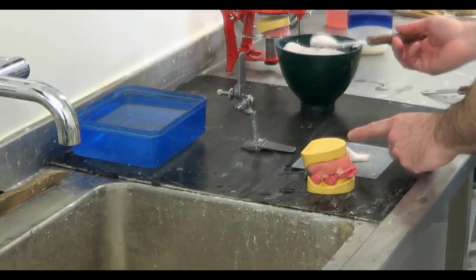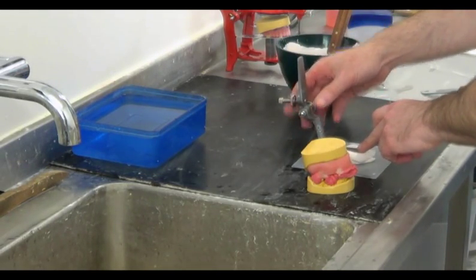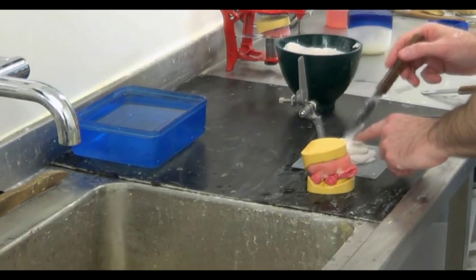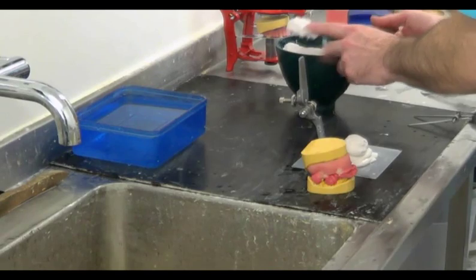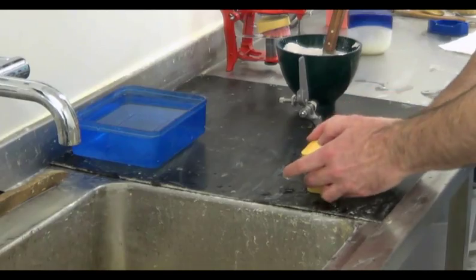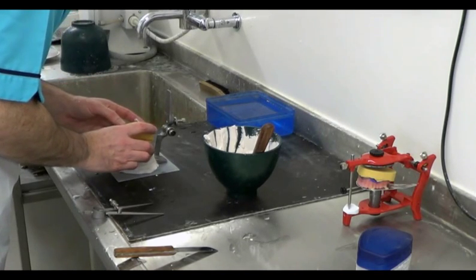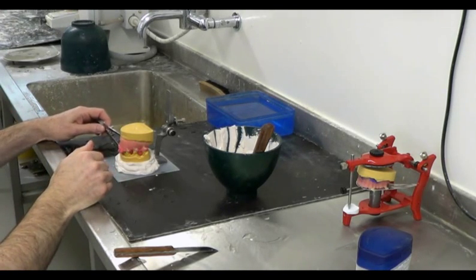We apply a small amount of plaster to the polythene sheet and sink the lower arm of the articulator into it, ensuring that the solid metal base is pressed firmly against the bench. Building up the plaster over the lower arm, we position the moistened models central to the articulator. It's also important to make sure that the occlusal surfaces of the models are level with the bench.